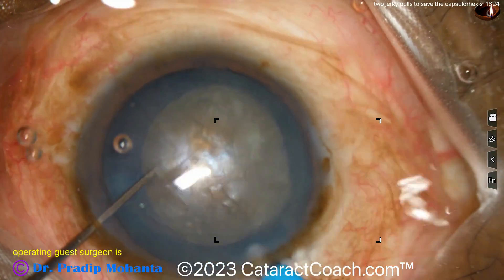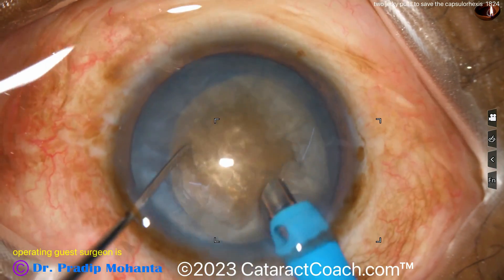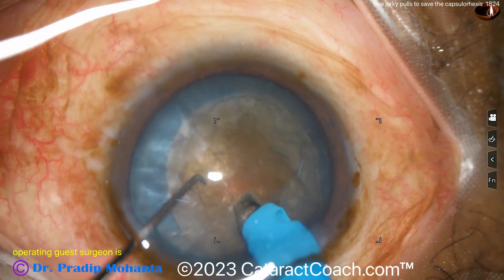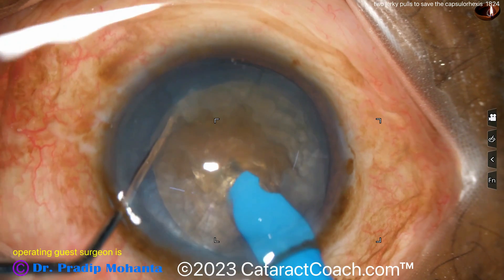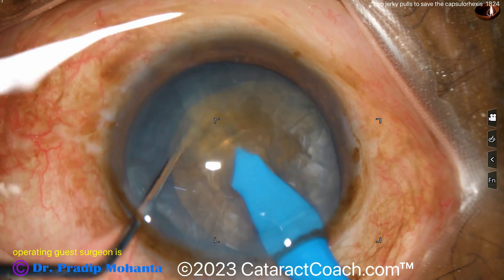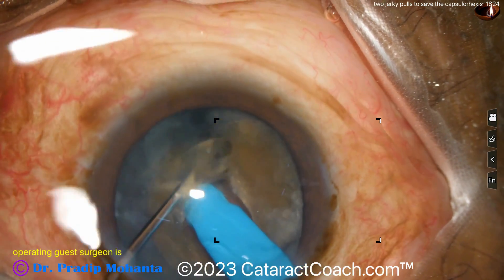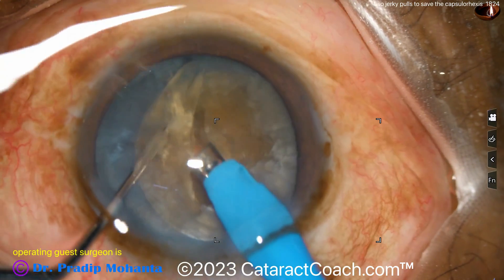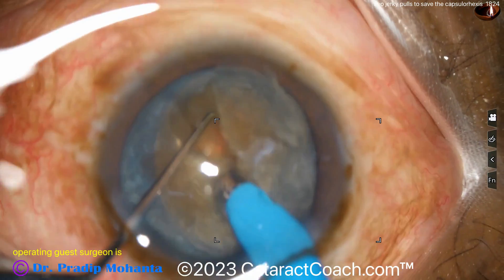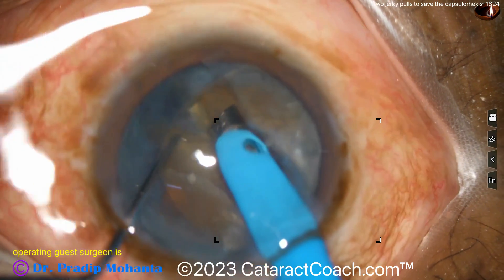Now going over the phaco probe — this nucleus can be chopped. These tend to be a little fibrous. See that yellowish brownish look? That's the density. These can have a posterior plate that's sometimes hard to separate. Holding the nucleus with the phaco probe and then a chopper goes in, splitting the nucleus. It's a dense nucleus, but here's the split — you have to fully propagate it. Look how it's fibrous, almost like splitting wood. You really have to go around. Grooving or debulking a little more to get that crack all the way propagated.